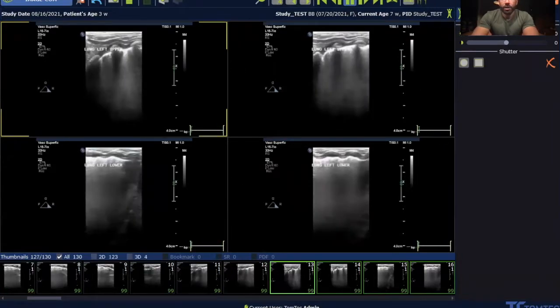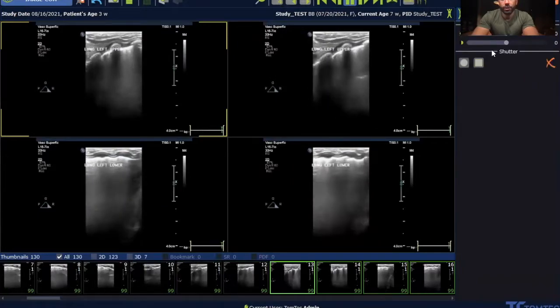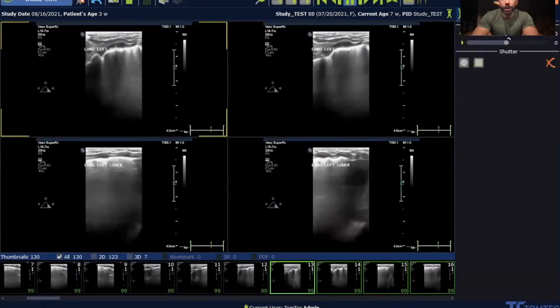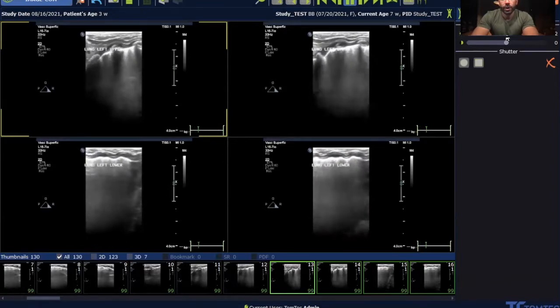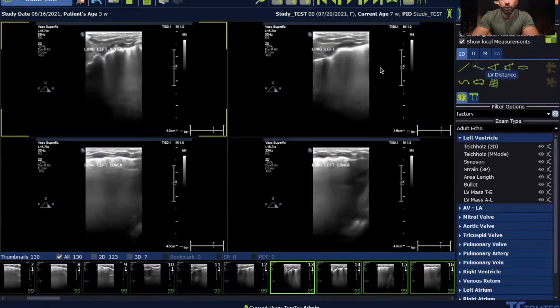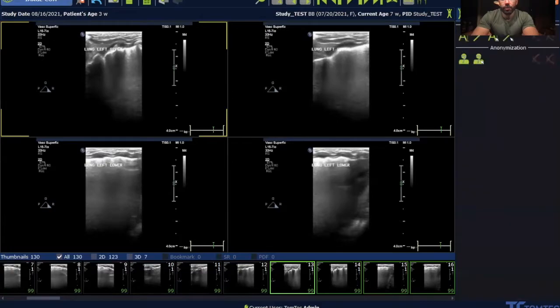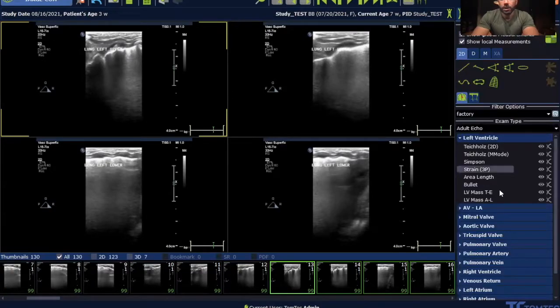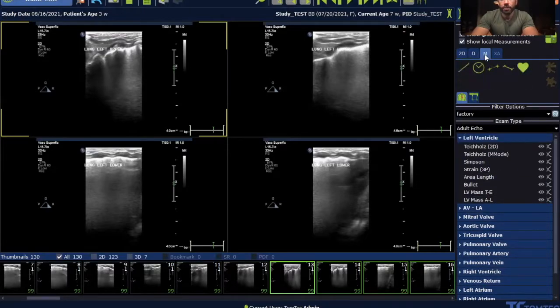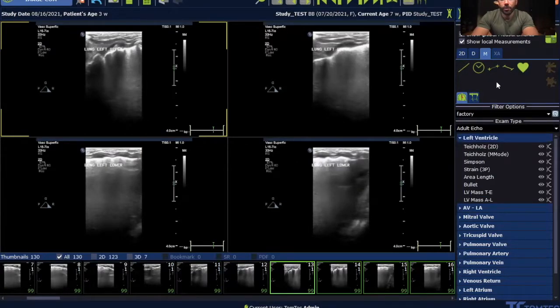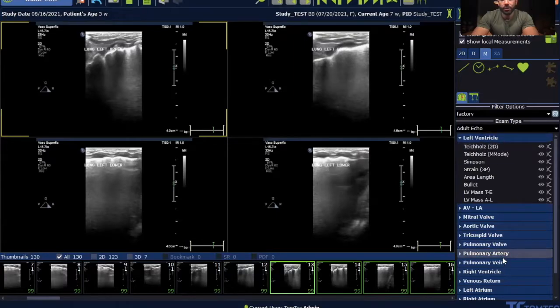On the side panel, you have different information. For example, you can adjust the brightness or contrast of the selected images. You also have tools for measurements, covering some conventional measures of interest — including 2D, Doppler, M-mode — and you can choose different packages for measuring different structures.